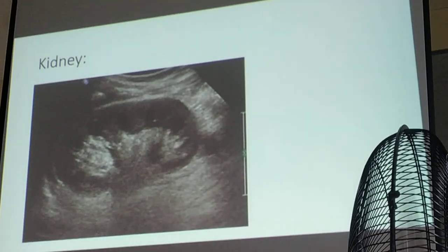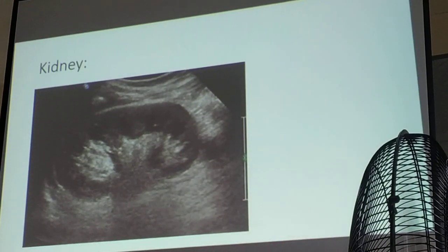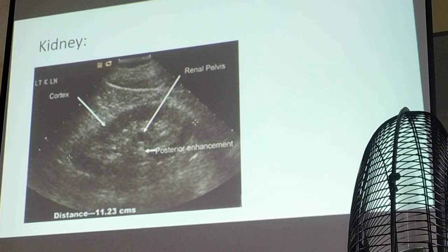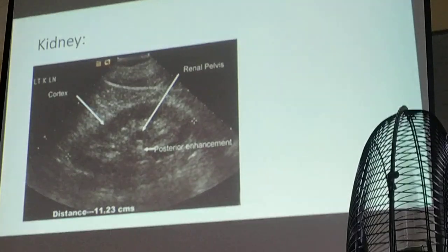And this is your kidney. It's a bean shape. Okay? So this is the cortex. This would be your medulla. Okay?